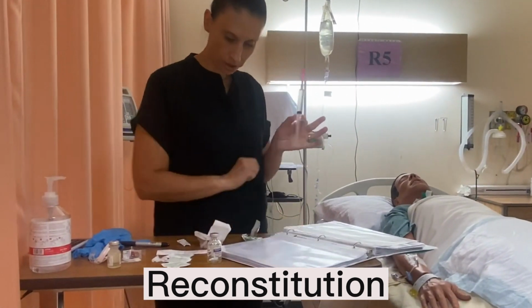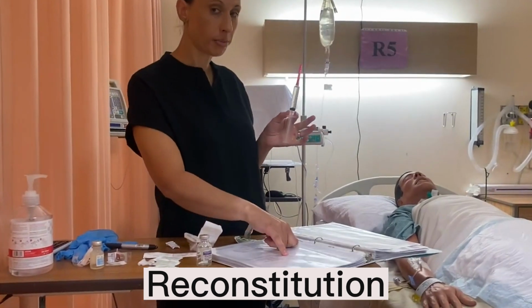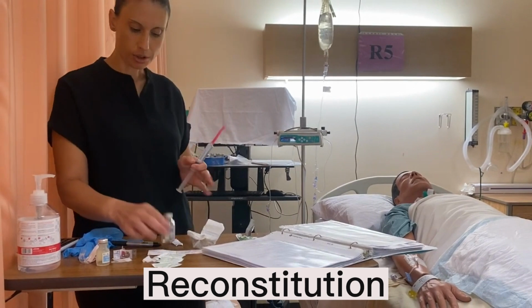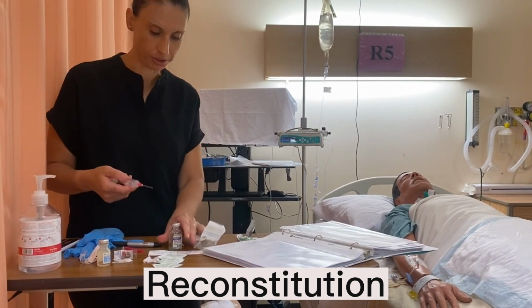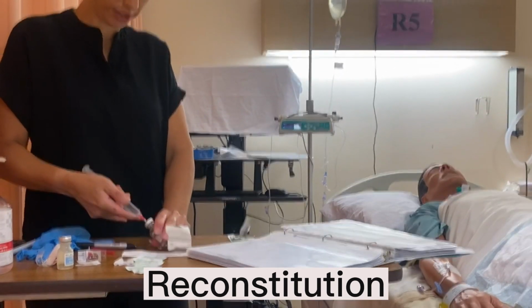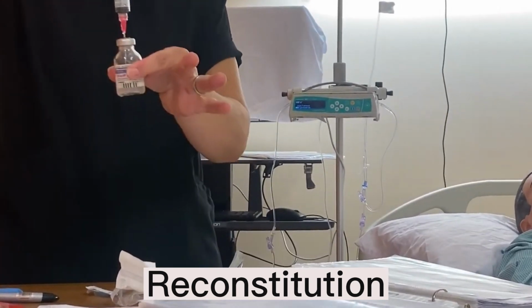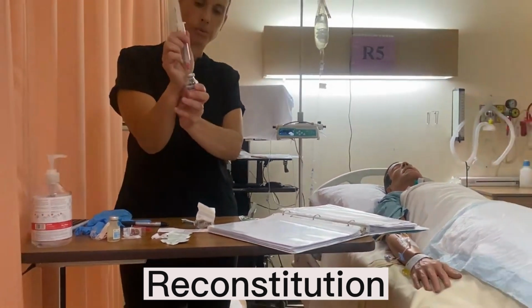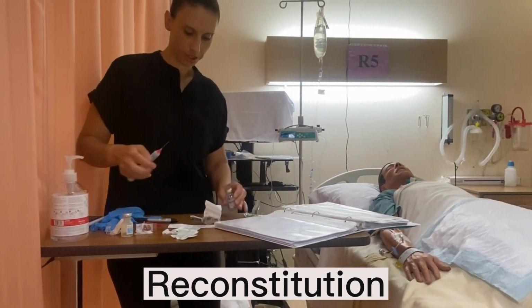Let's see, it's sterile water. And notice it was sterile water, not normal saline. Our PDM said sterile water it had to be. Okay. Now we've already swabbed the top for our meropenem. So now I'm going to instill the 10 mls into there. And now I'm going to release the pressure so that it doesn't spray back at me when I pull this needle out. Okay. Pull that needle out.